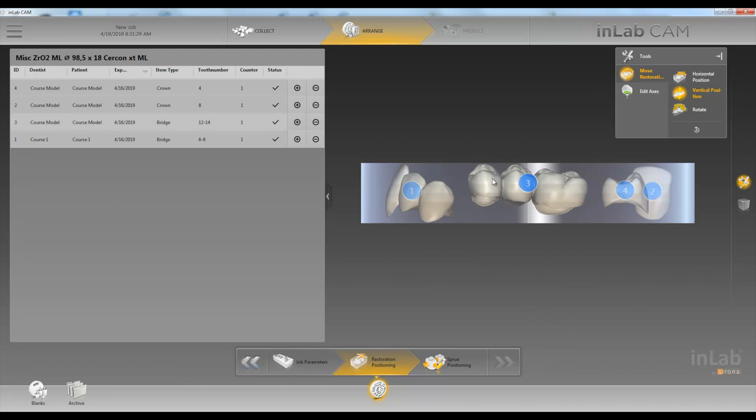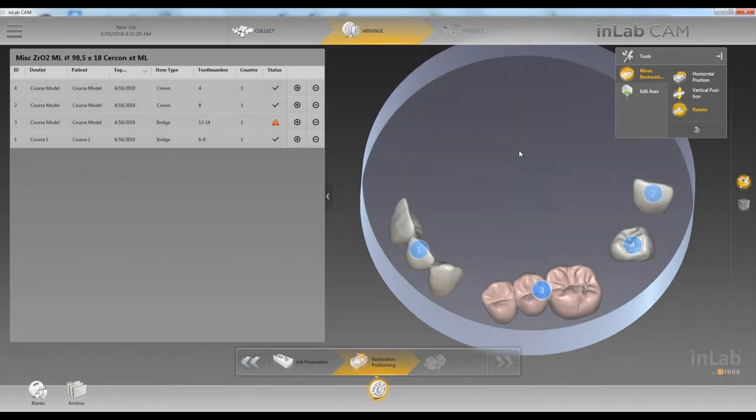If this restoration has more incisal than this molar, we can go ahead and rotate it as well. Click on Rotate. Now we have a more even distribution of our incisal.